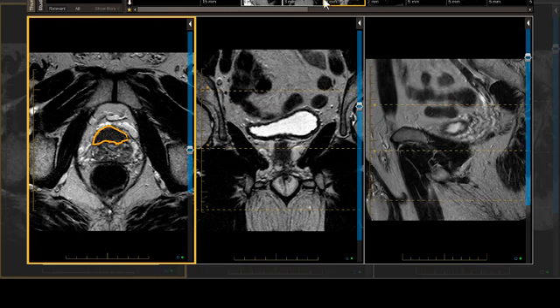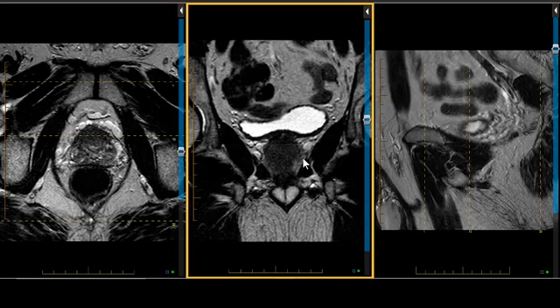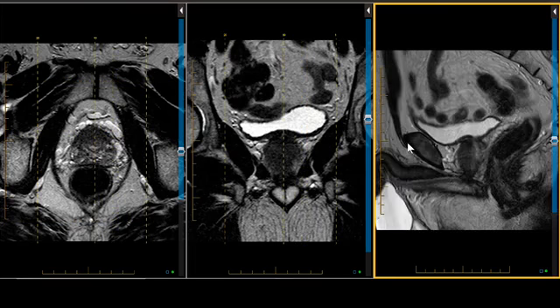Now you might say to yourself, well, okay, how much is too much? Well, I've given you a number, but don't get so fixed on the number. You know, maybe there are some people that have a 9 millimeter anterior fibromuscular stroma. Maybe they have a 3 millimeter. So let's use what's available to us. So let's go to the coronal, which is probably going to be the least useful projection because we're tangent to or parallel to the tumor, but it's awfully smooth and gray, charcoal-like. That's a bit disturbing. Let's go to the sagittal, where it might be more helpful, because we're going to be perpendicular to this potential crossing side-to-side tumor that is blending with the anterior fibromuscular stroma.